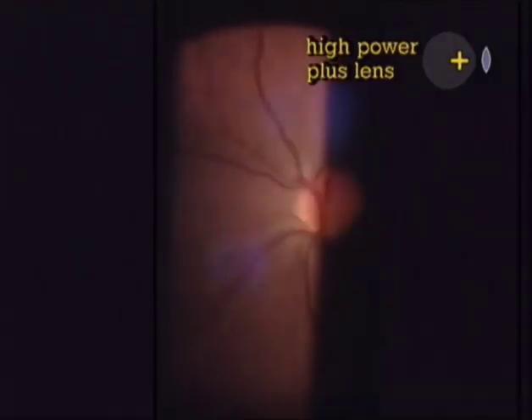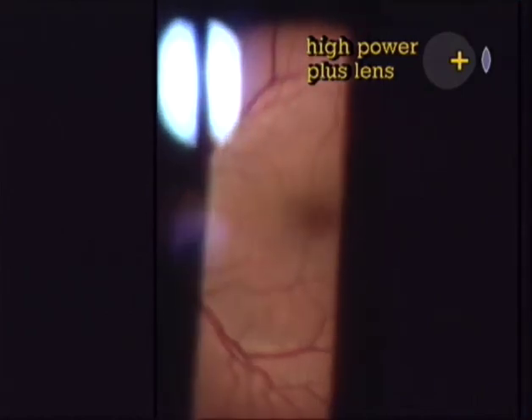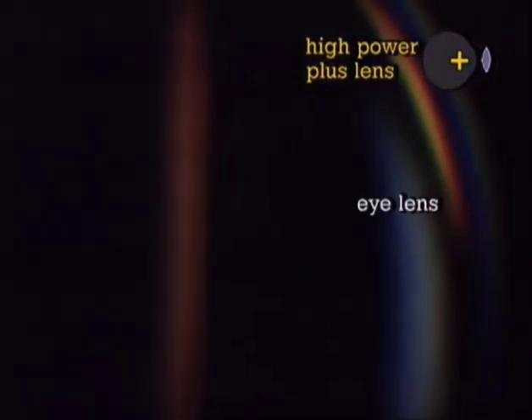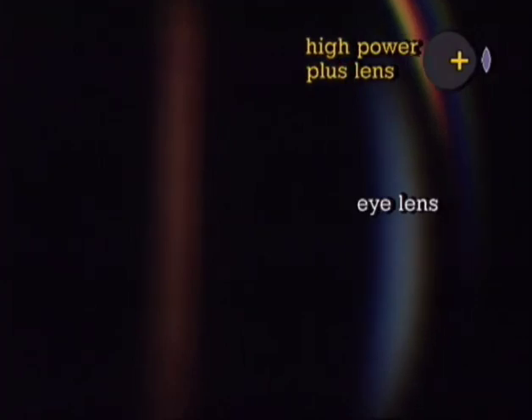When scanning a wide field with the high-power plus lens, this flattening is an advantage because large areas can be sharply seen despite the low depth of focus of the microscope. A narrow slit, however, appears straight. In the anterior segment, based on heavy deformation, the lens looks like a banana. This deformation may be a clinical problem.